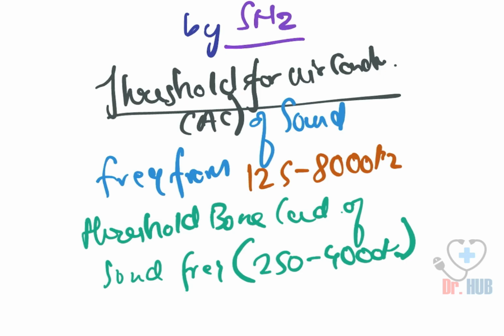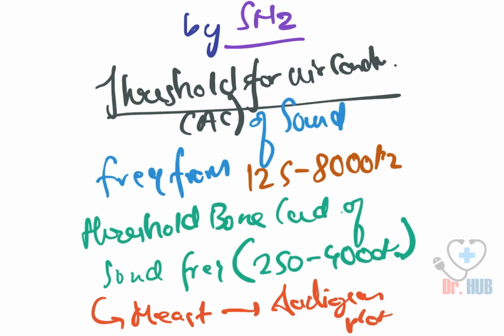So this is measured and it is plotted on the audiogram.